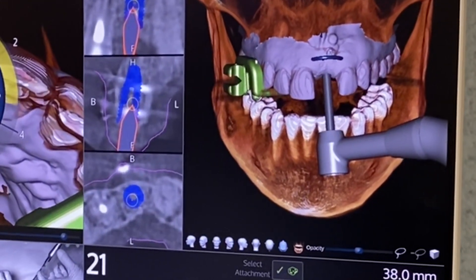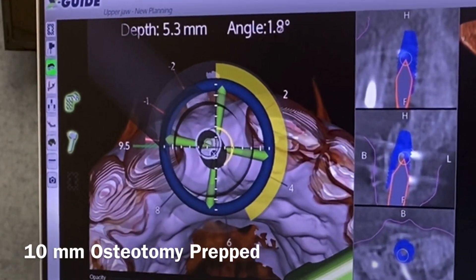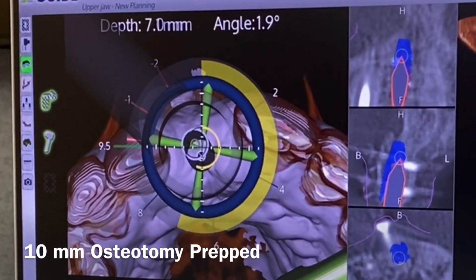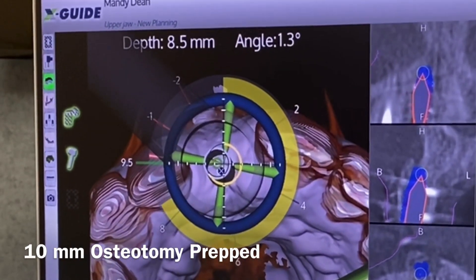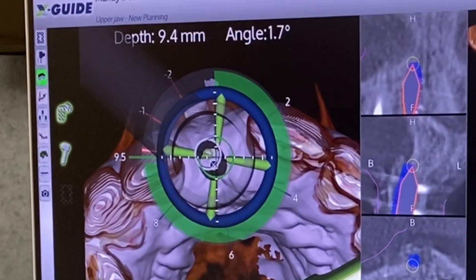As we go back in, we can see that we're going down to a certain depth — getting down to the depth for placing a 10-millimeter implant here. We're going to take it right up to the 9.5 mark, or just ahead of that, and this tells us we're going to be in the right spot for placement of the implant.